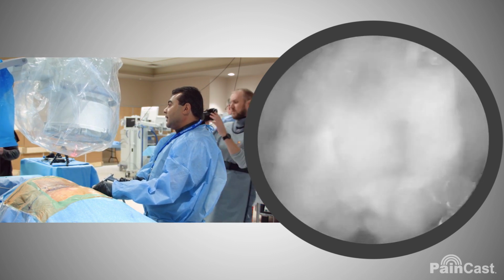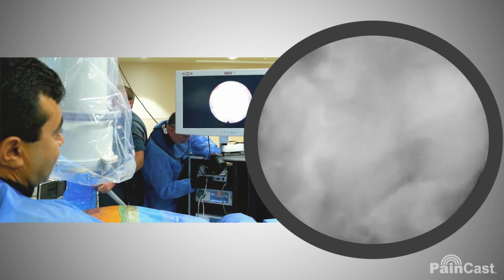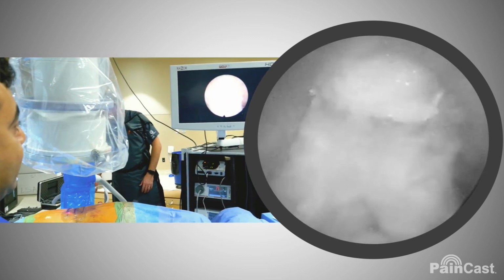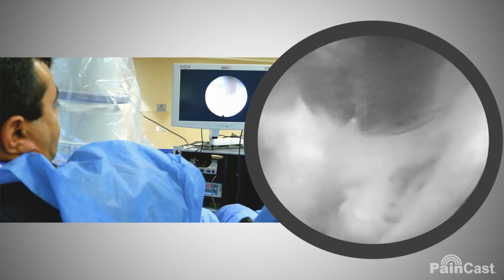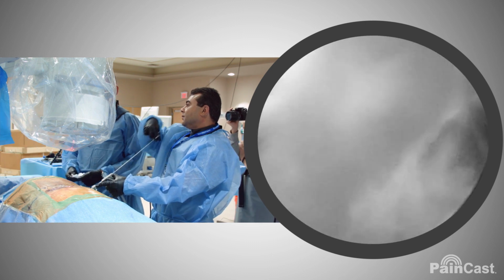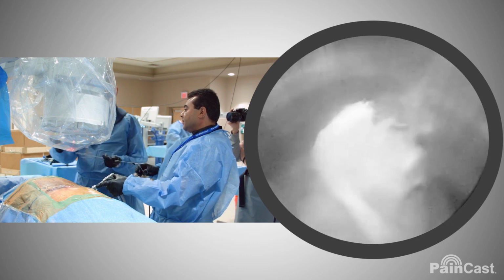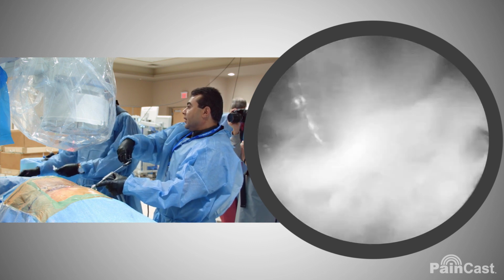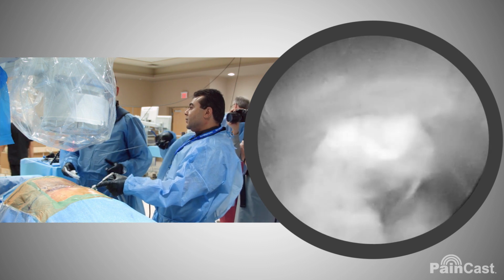Going here, that's inside the nucleus, and we grab the specimen here. There are so many graspers and pituitaries that can give you the work that you need. One with articulating, one with non-articulating. So you choose the piece that you like and you're comfortable with, and you do your work.